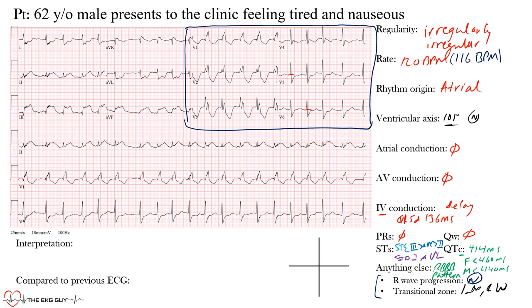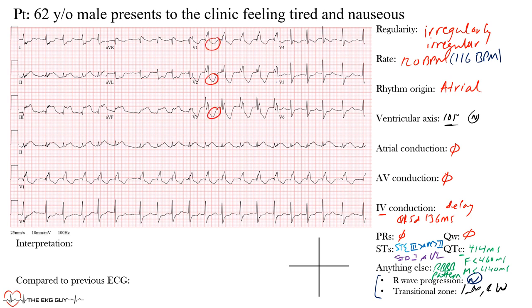You may have noticed inverted T waves in certain leads and wondered why I didn't mention them earlier. With a right bundle branch block, discordance — meaning opposite ST-T findings in leads with the terminal R' — is expected and normal. Negative T waves in those leads are normal findings in RBBB. If they were upright, I would be more concerned, but these are expected changes.